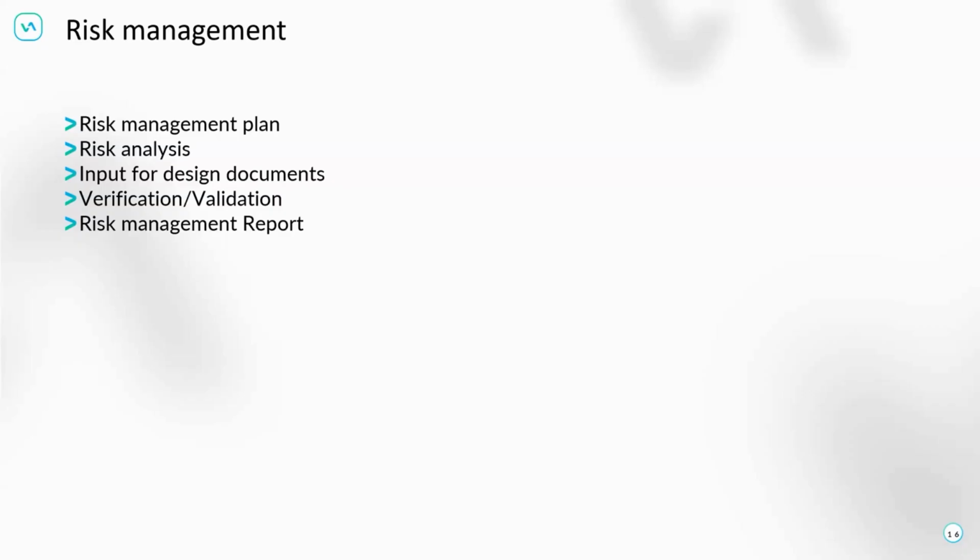At the end, the risk management report, as it's part of the technical documentation, is where you point out and decide that this particular product is most likely safe. It has a few open things which are disclosed in the user manual, which are not fixable because that's the user's part, or a part where you cannot do a lot or don't have much information, and that's something you need to cover in an additional way. So the risk management report closes all the activities, like you do with the software release review.